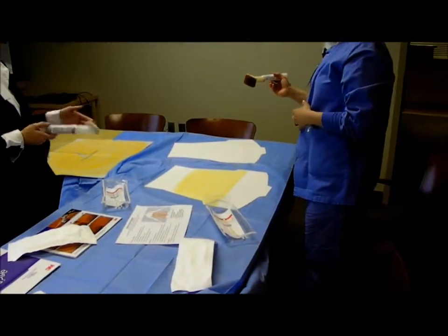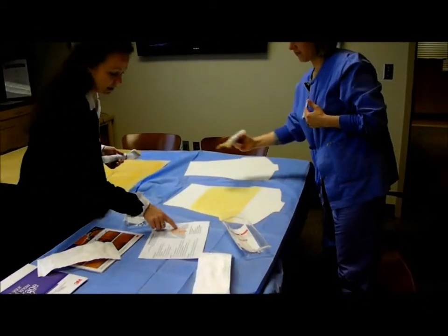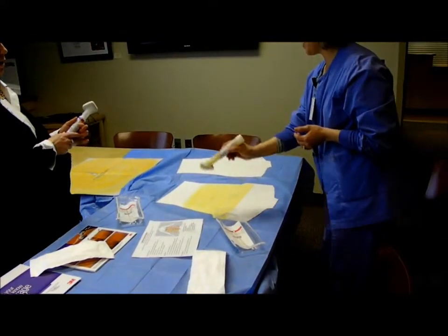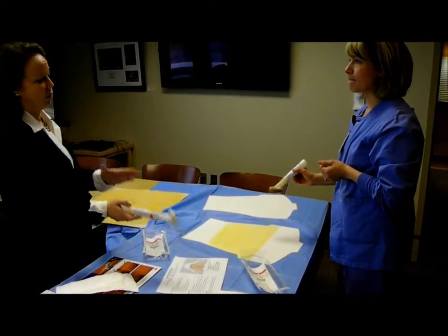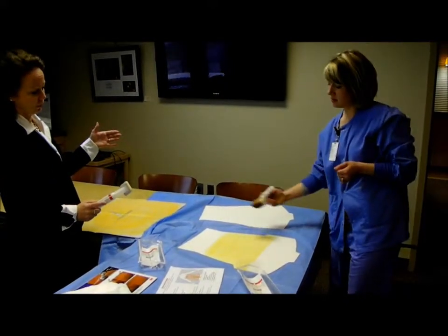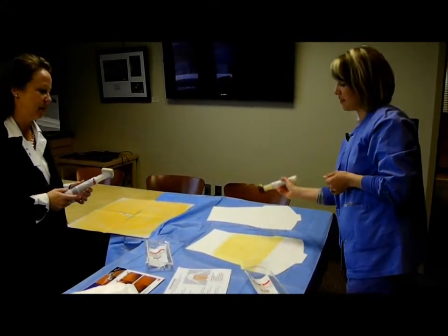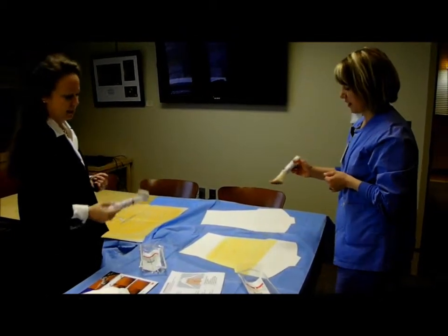A lot of people do the sides next. Yes, and our diagram is not the real thing. If it were 3D, I would do the sides. So this area here is all contained within these swipes. But with someone that's really large, and this is not a hard rule, you don't have to do it this way, especially with a pregnant belly, you may end up doing one side to the bed, but not touching the bed, walking to the other side, and then doing the other side. Because you don't want to reach over a really big belly and risk contaminating. Sure. Oh, that's right, so you're 12 inches away.